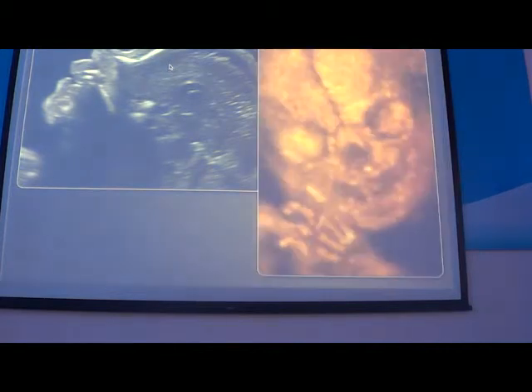Vào thời điểm 20-22 tuần thì chiều dài xương sống mũi 5 đến 7 mm. And you can see here, we don't have one nasal bone, we have two nasal bone, one right and one left, with a fusion between the two. Với cái mode maximum này các bạn thấy ở đây rõ ràng là hai xương sống mũi bên trái và bên phải với cái vùng tiếp cận ở giữa.